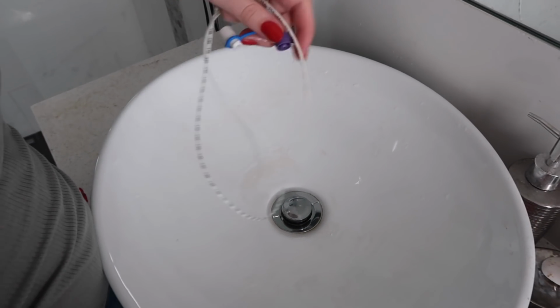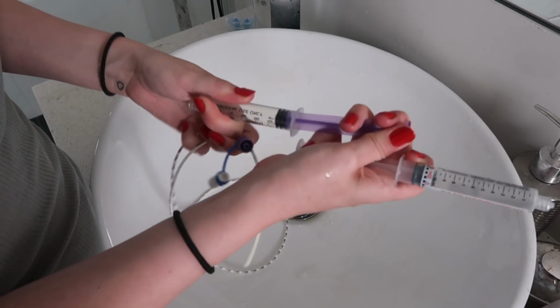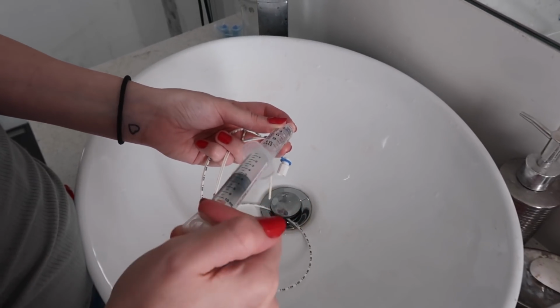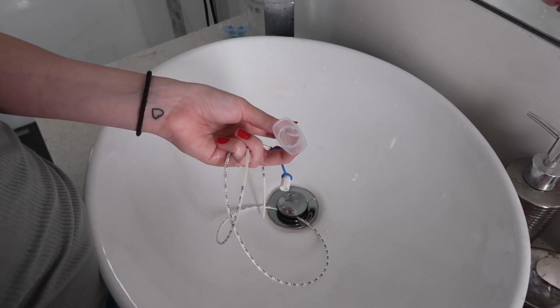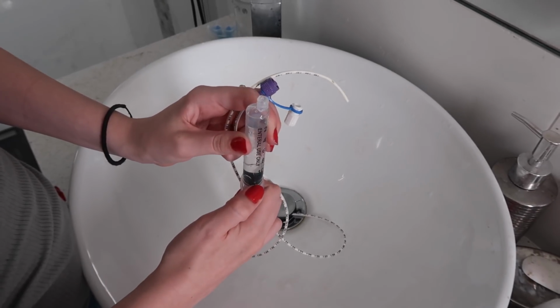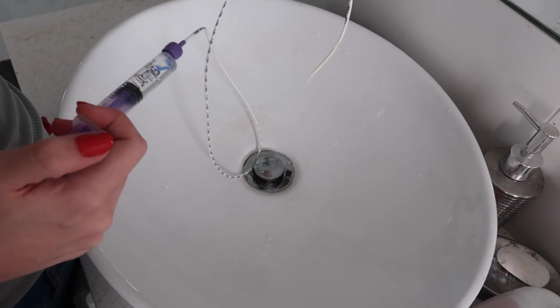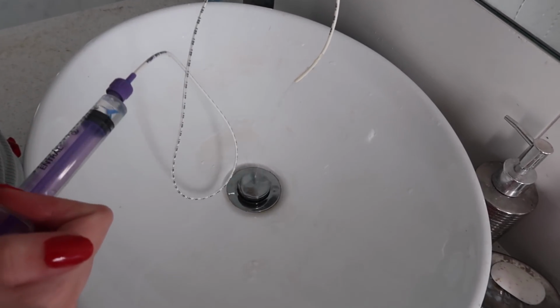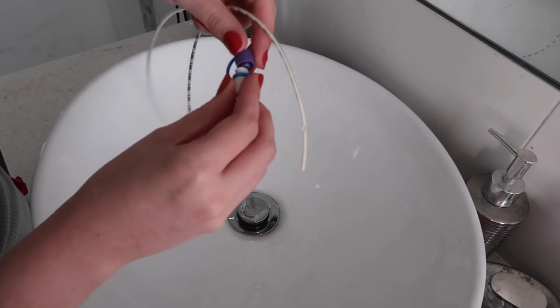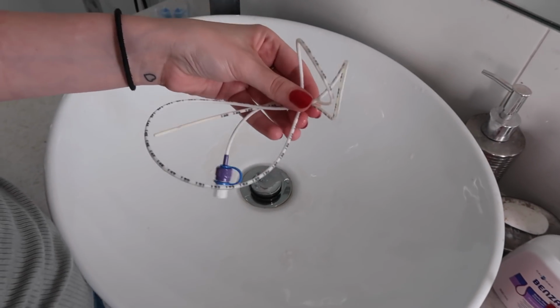And then we're going to take the sodium chloride one that I talked about. Because I don't have an end that fits, we're just going to fill this syringe like that, and then pop this end back in, and then get the air out. Not that it really matters, guys, but just to flush through the tube like that. And that is pretty much as sterile as we're going to get it without it being a fresh tube. So now I'm going to just wrap that in a tissue. I'm going to go back to the room and show you how I store it.